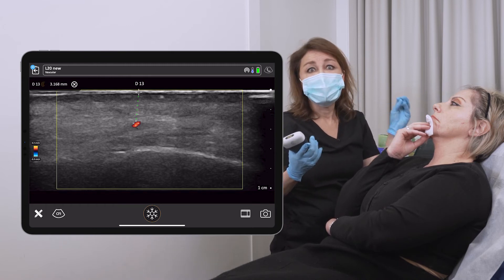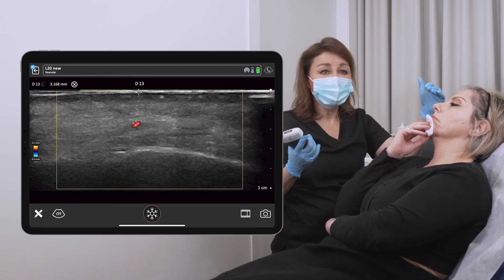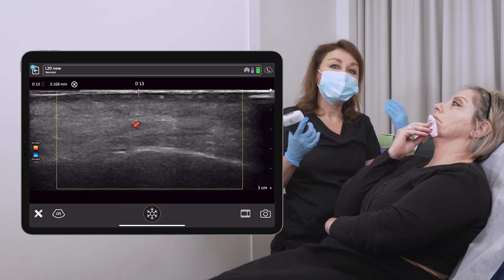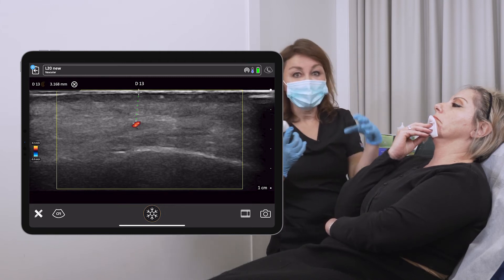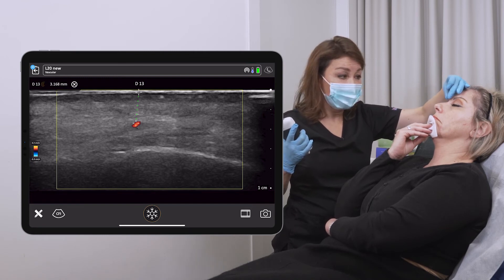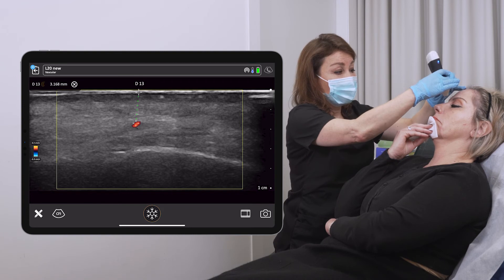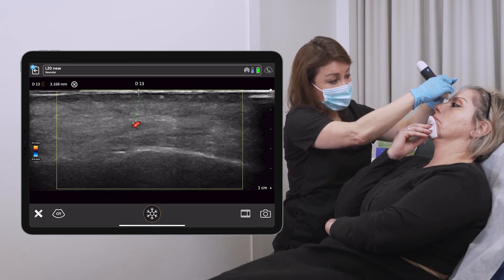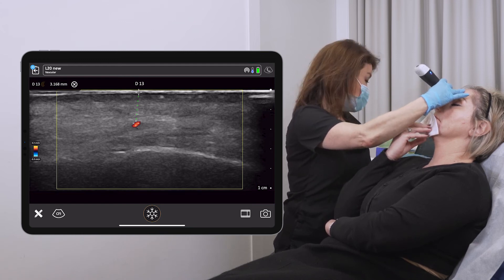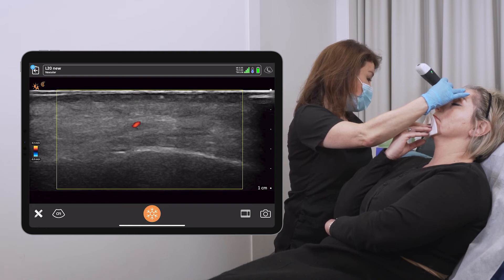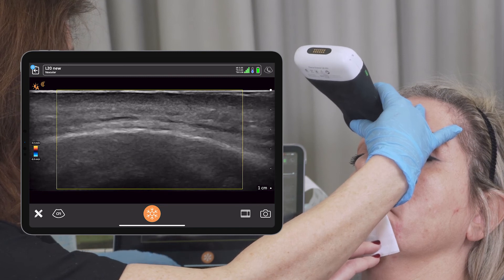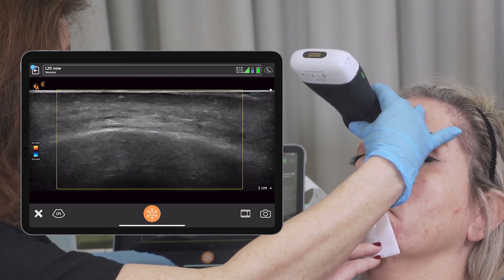Now that I can see where the arteries are, I will naturally move to another area and inject either laterally or medially to the arteries. In this patient's case, we can inject the glabellar area more centrally. Having mapped the arteries, we could inject more medially in the glabellar area where there are no larger vessels.